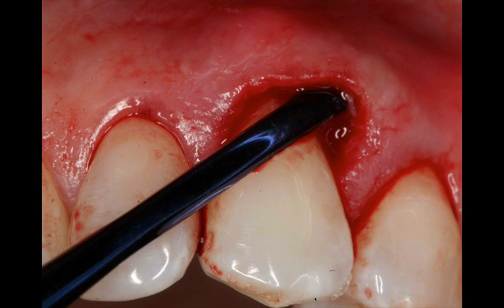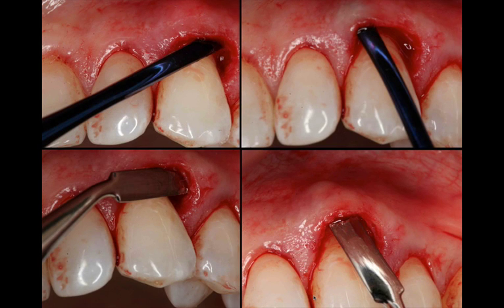So when you're using tunneling instruments, you have to use them very carefully. They often have certain curves that are by design to allow you to reflect the tissue, work very close to bone. Often we work in full thickness because we are trying to prevent perforations. And when you tunnel, it's very important to take your time, take advantage of the different shapes of the instruments, and very carefully work your way in an apical direction, sometimes in semicircular movements.